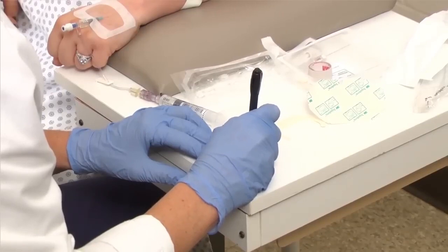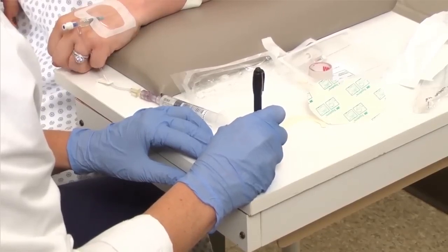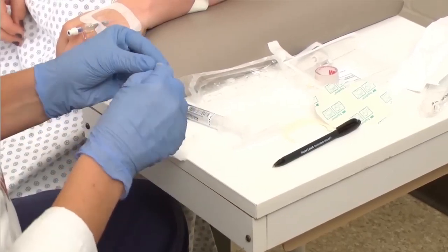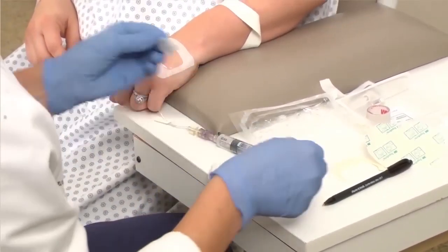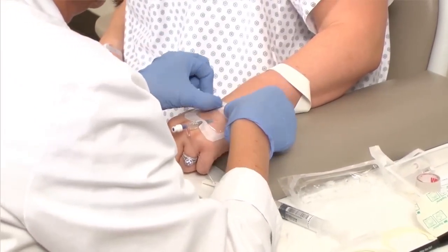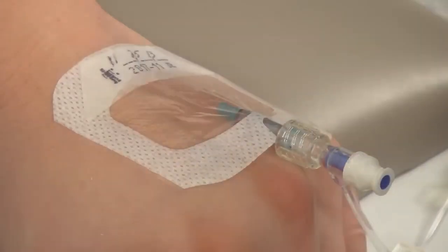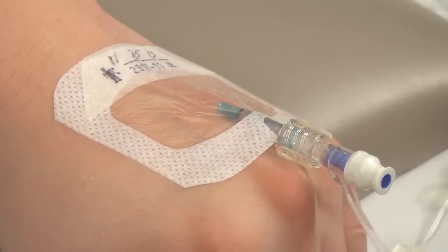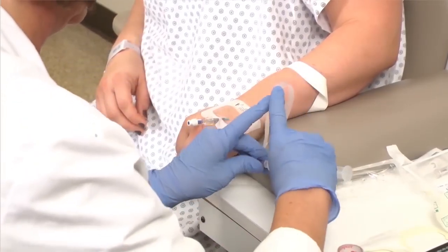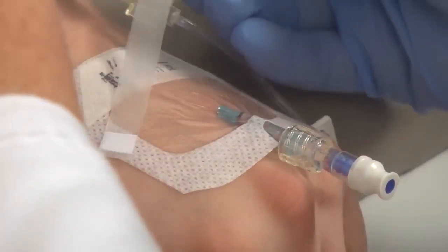Once the angio is secure, you can fill out the date and time sticker. Remember to do this before affixing it to the dressing. When applying the sticker, place it so the insertion site can be seen and assessed. Secure with tape as needed.